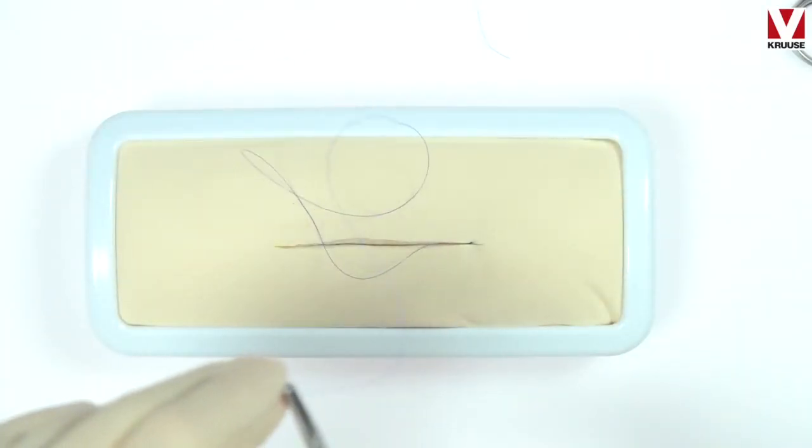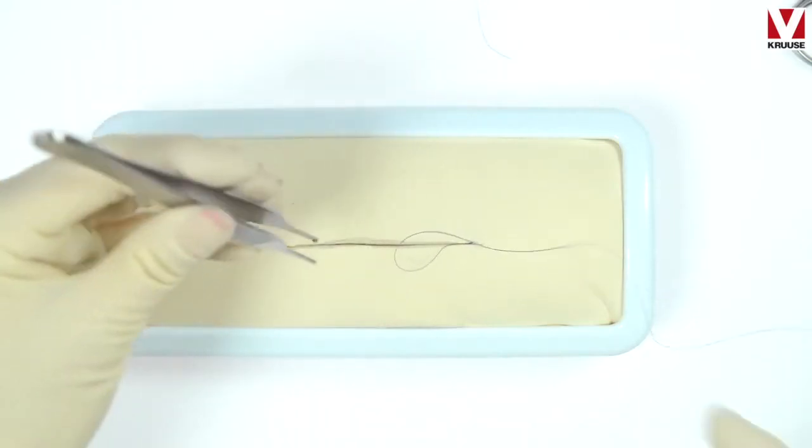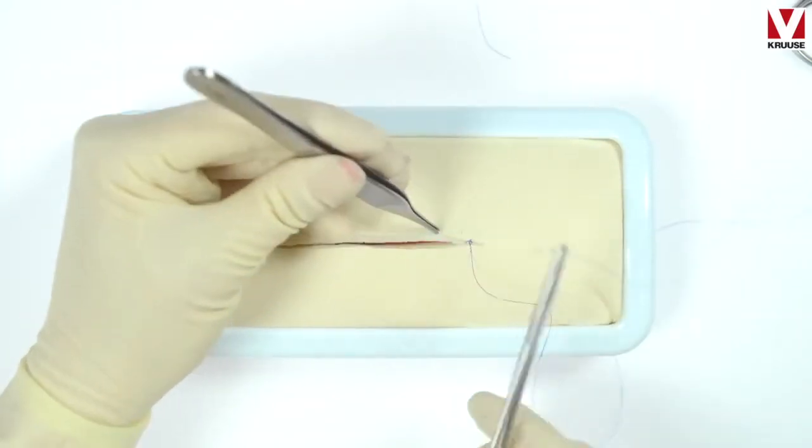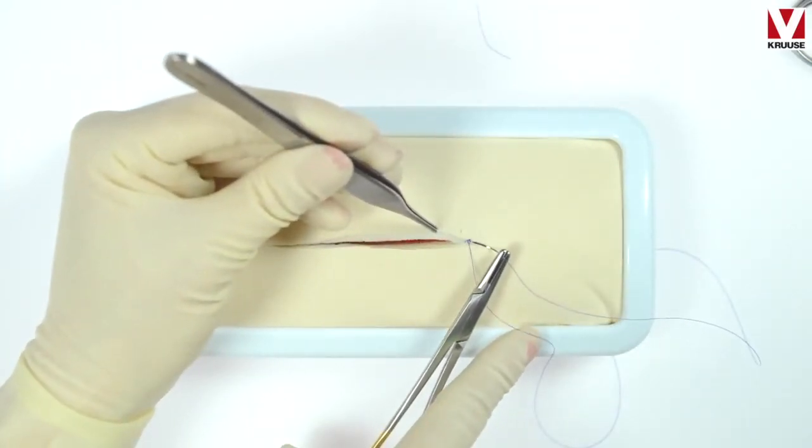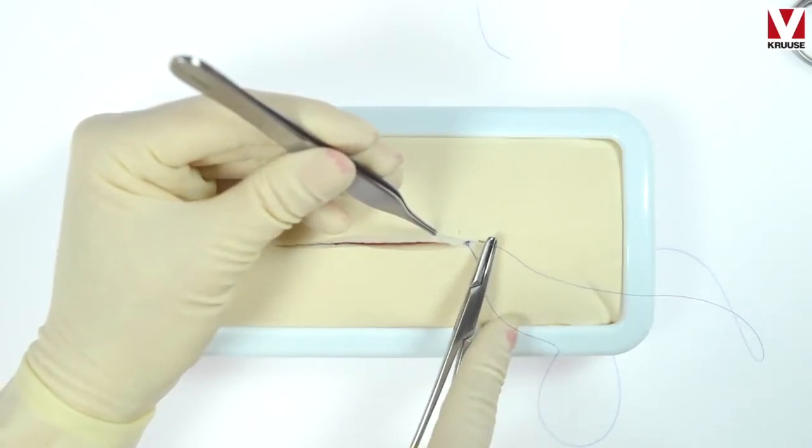I am ready to start the continuous pattern and here I start behind the knot that I just buried to close the incision completely.